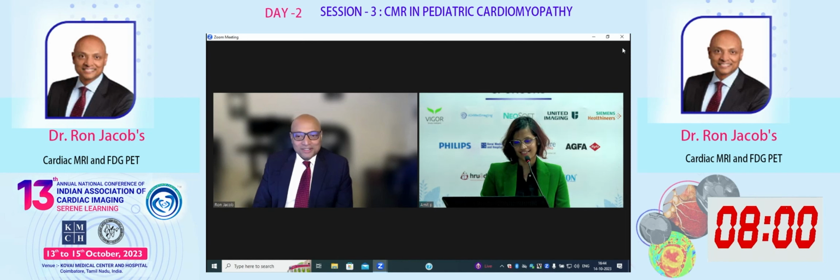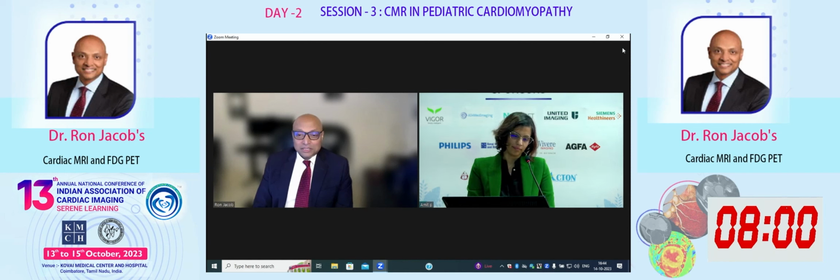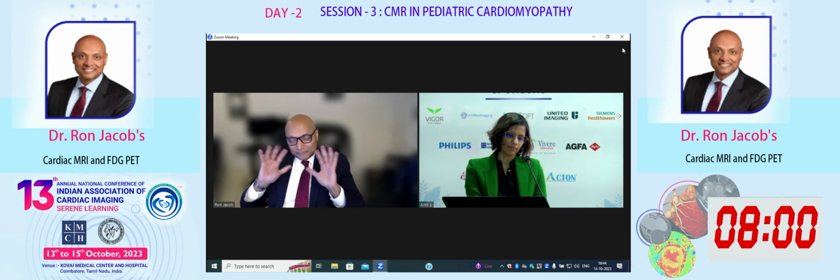Your average resolution with a segmented LGE is about 1.5 millimeters. The atrial wall, on a good day, is 1 to 2 millimeters. If you have AFib and an atrial myopathy, maybe it'll get to 2.5. So just basic physics.